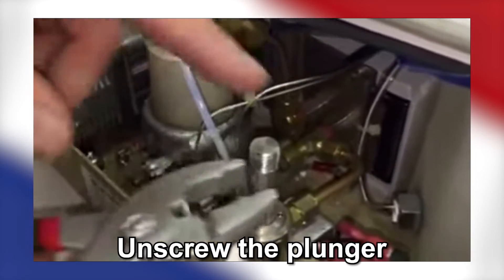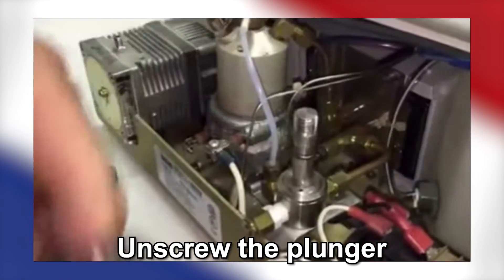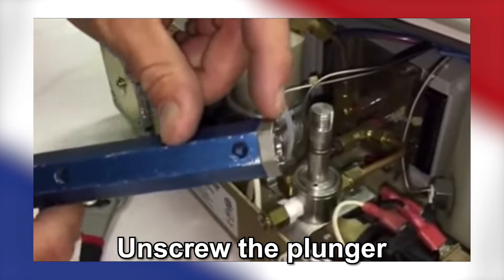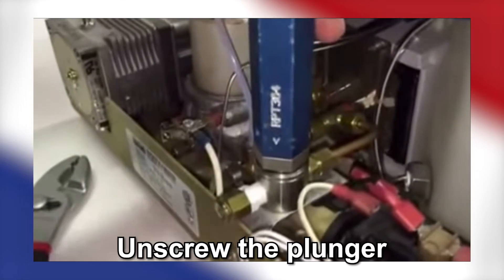The plunger shaft can be removed by placing the pliers right below the threads of the bolt and twisting it off. Or, you can use the spanner wrench mentioned before to remove the shaft by aligning the two pegs of the spanner wrench with the holes of the plunger shaft and unscrewing it that way.